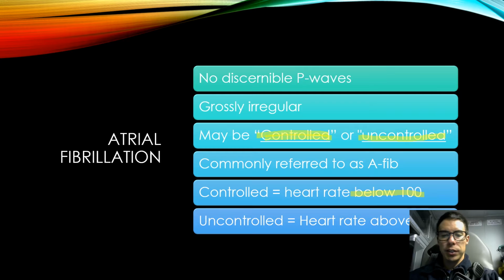And I think my video's in the way, so you probably can't see that, so I'll just make a note here. Uncontrolled is above 100 for heart rate.